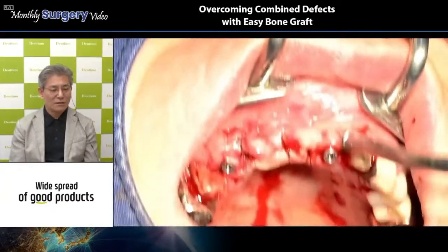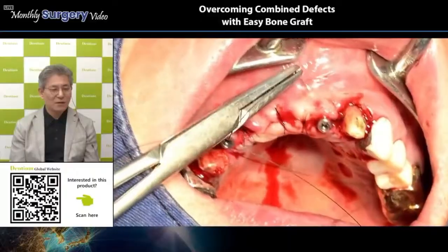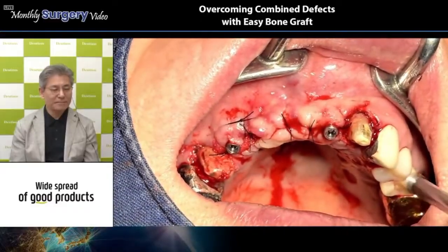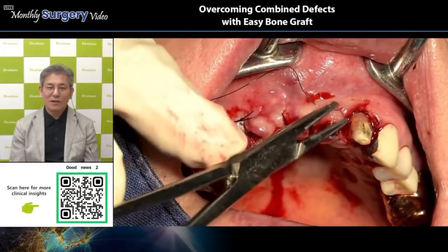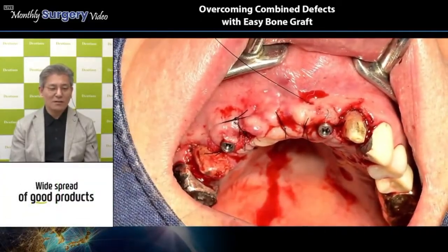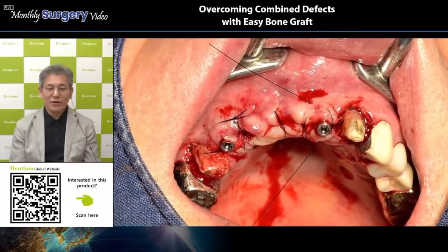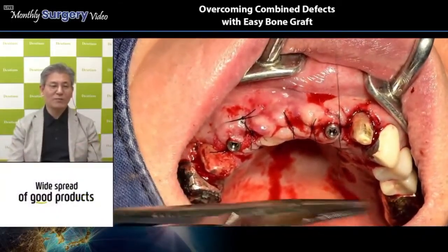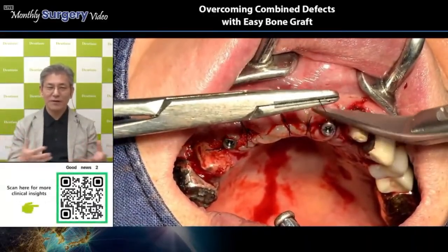Okay. The interrupted sutures were done one by one, and now he made one more on this 21 area. Did you see the incision design? Generally speaking, for a proper GBR procedure in this anterior area, as you know, we need big vertical incisions.